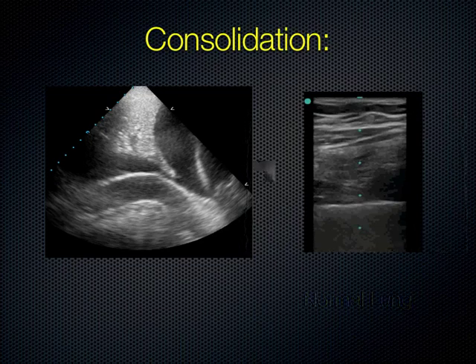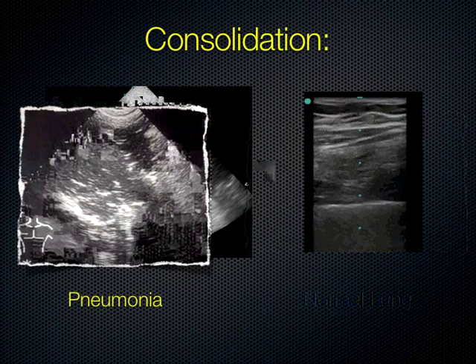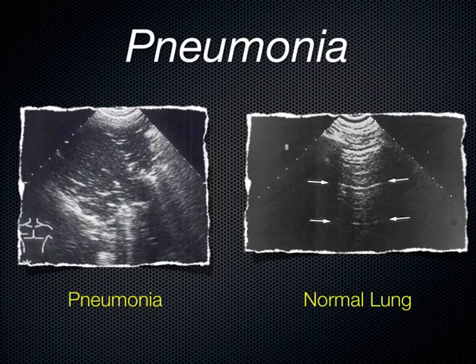If you go in all eight of your quadrants, basically, quadrant on both sides, you might be able to even say this is a right upper lobe infiltrate and compare that with your chest x-ray, because not everybody has full pneumonia on both sides, and it's a good thing. You might have one lobe affected on either side, and you can start to hone your skills by trying to find it and then comparing it to the chest x-ray.